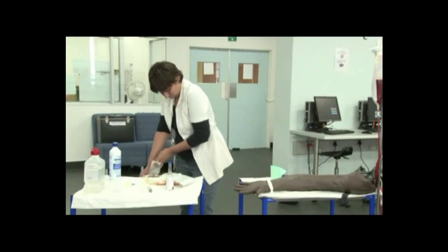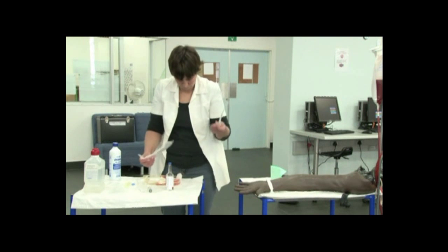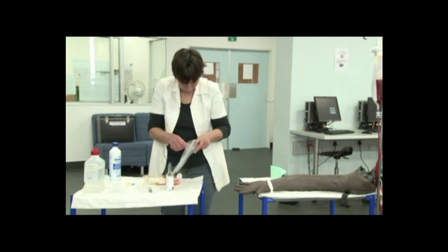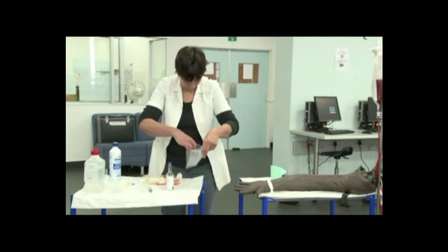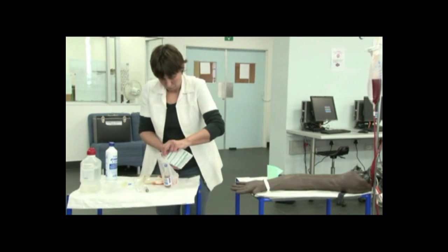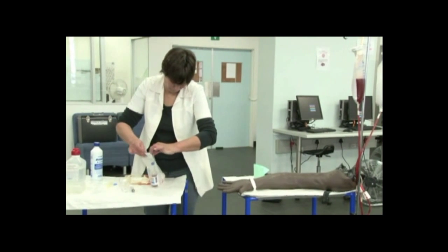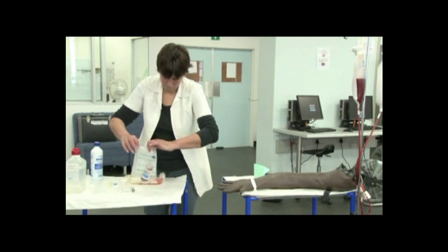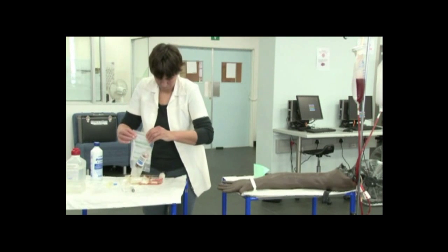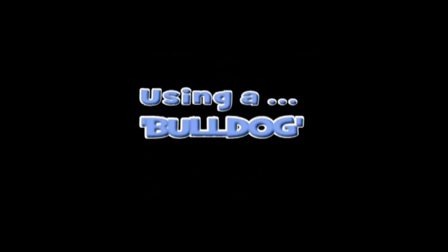Complete the laboratory request form, including the site, date, and time of collection. Full clinical information regarding the suspected diagnosis and contact details for the clinician responsible for the patient. Deliver the blood culture bottle to the laboratory as soon as possible. Do not refrigerate the bottle. Rather, keep it at room temperature.